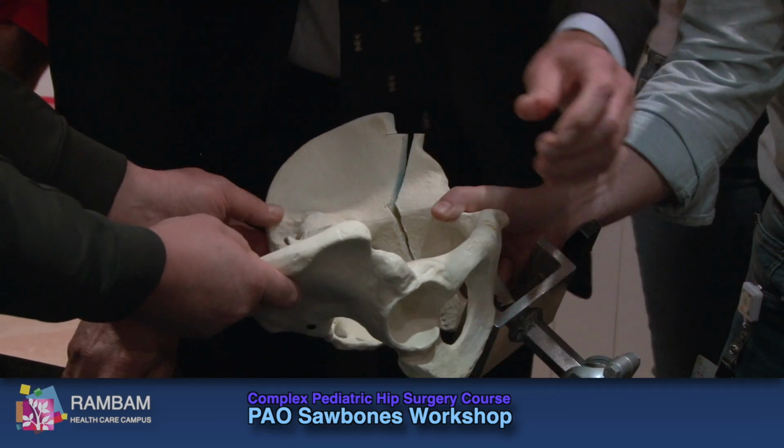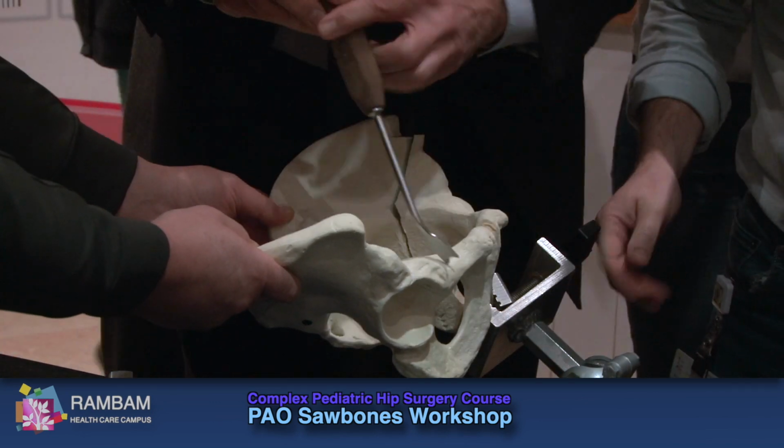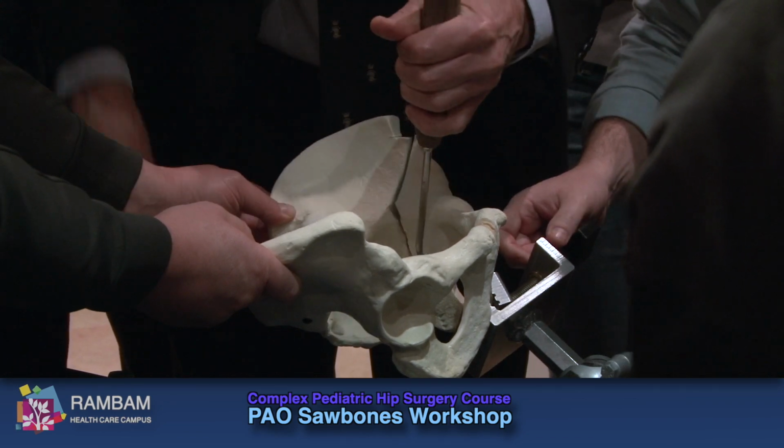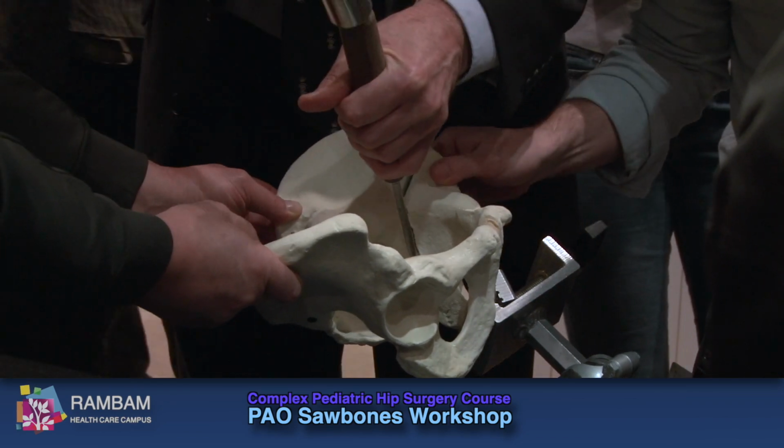Now that's cracked all the way down to this bone. Then the next thing you do is this portion. I go there, and there, and connect this part.